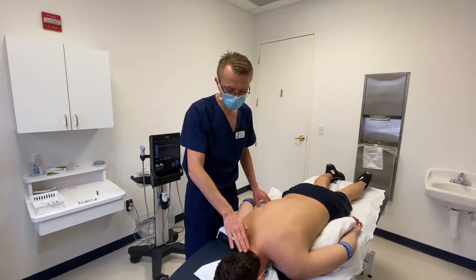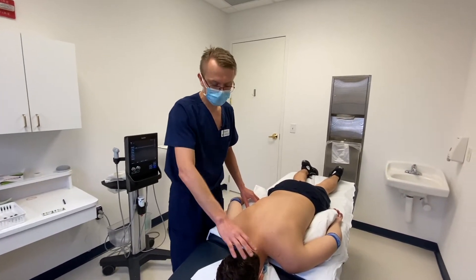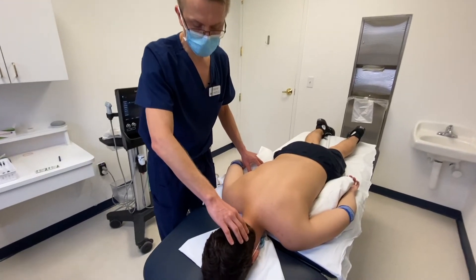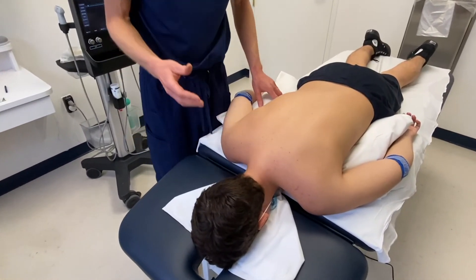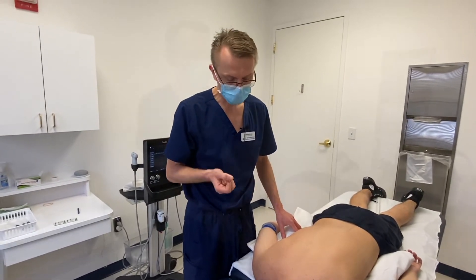We're going to be injecting his upper neck, lower neck, his shoulder blades, and the attachments of the muscles to his head. That will create some stability and prevent the pain and headaches that he's experiencing.